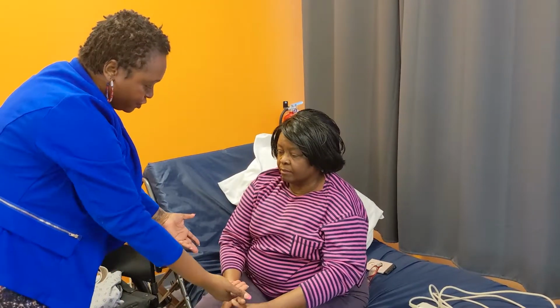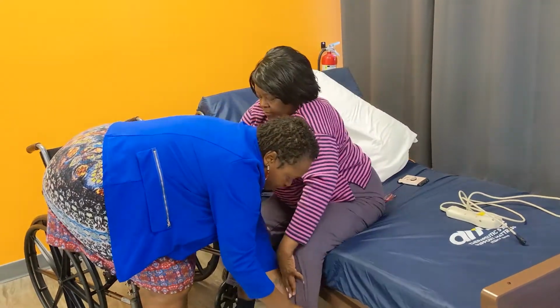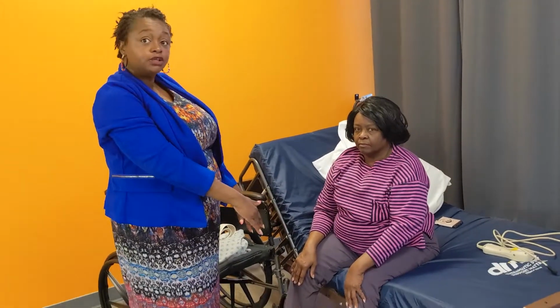Can you scooch your bottom forward just a little bit? Don't stand yet. Scoot your bottom forward, plant your feet on the ground. Okay, so this is a good position here. The patient's feet are planted on the ground.